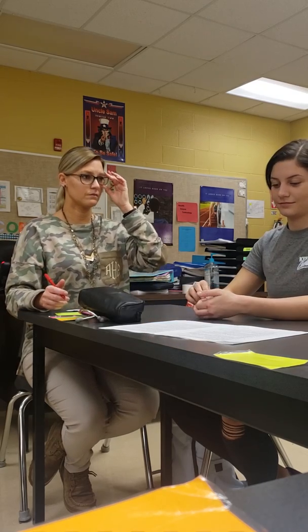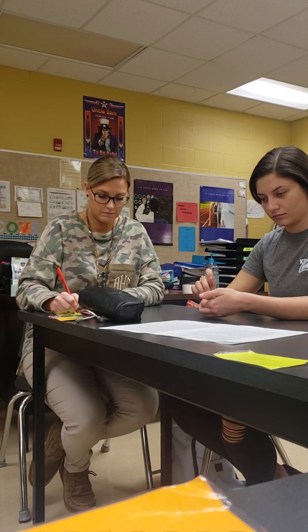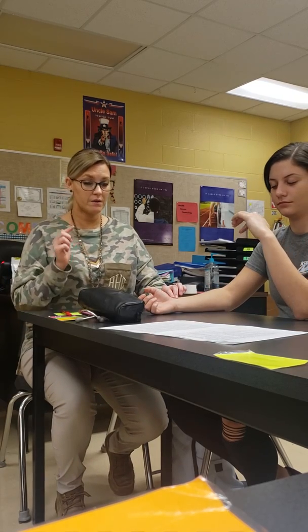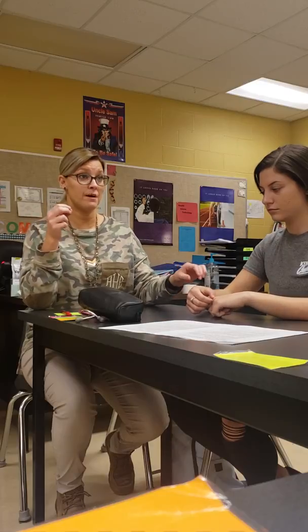Okay, so you multiply it by 2, and then you continue to hold the resident's wrist and count the chest rise for 30 seconds, and you'll multiply that one by 2 as well. When I was checking her pulse, I counted for 30 seconds, and then I immediately went straight on, and I thought, okay, what is that number? It is easier for me not to multiply right then. It is easier for me to just remember the number that I stopped on, and then immediately start counting respirations.